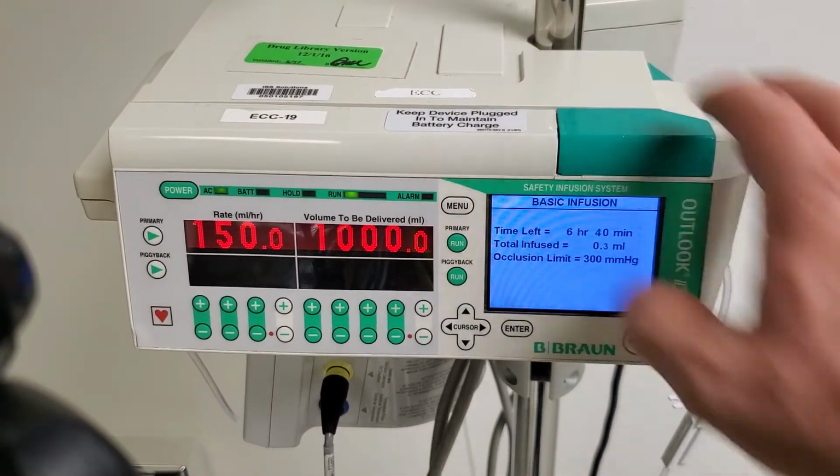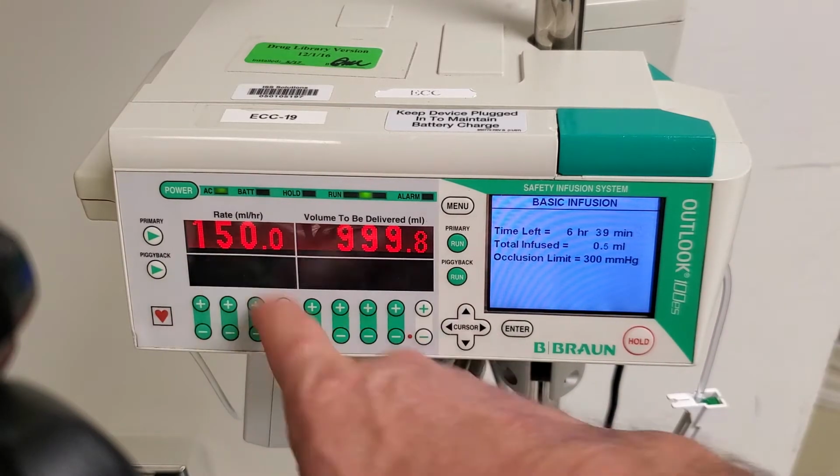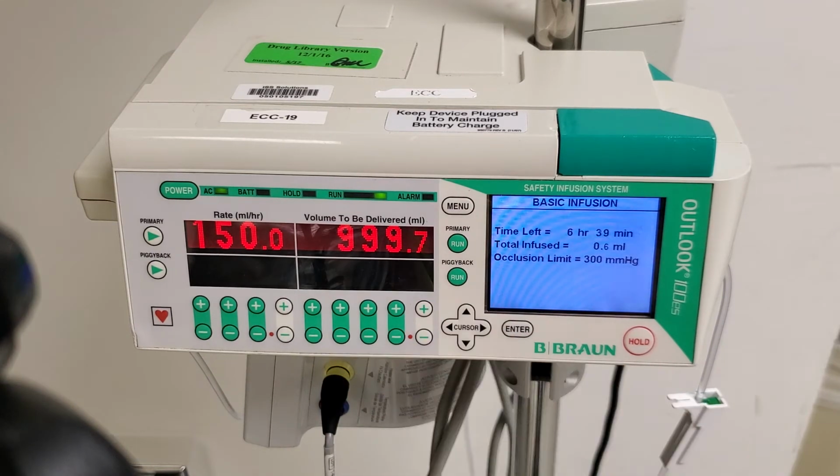1 liter. We'll start that running. So let's presume that we're administering an antibiotic. We have D5W running at 150 mLs an hour for a liter, and we want to administer 50 mLs of an antibiotic at a different administration rate. They might want that over half an hour.